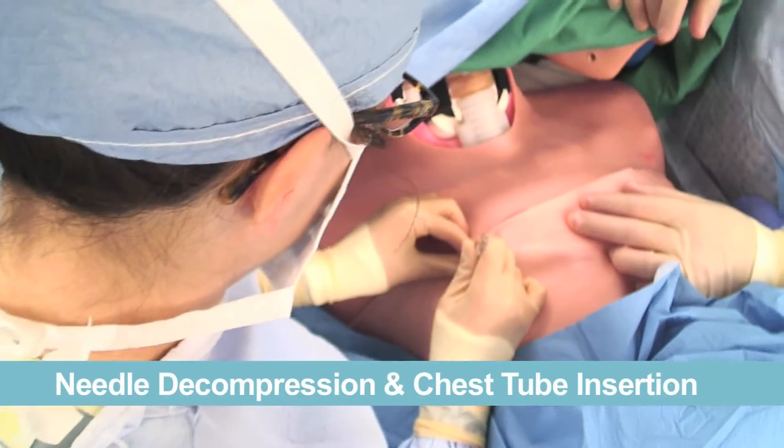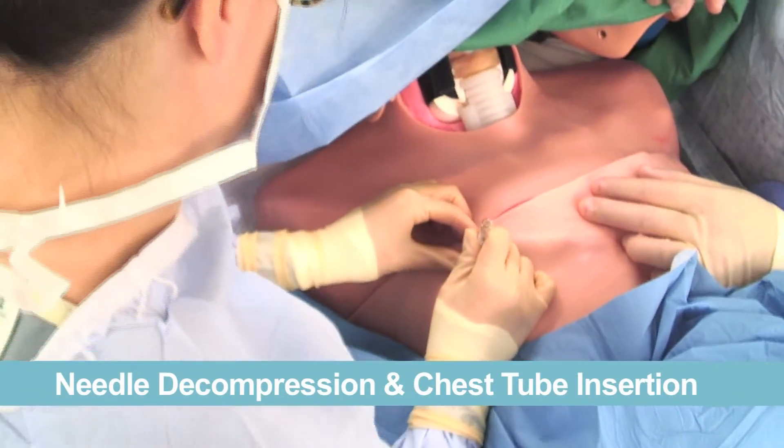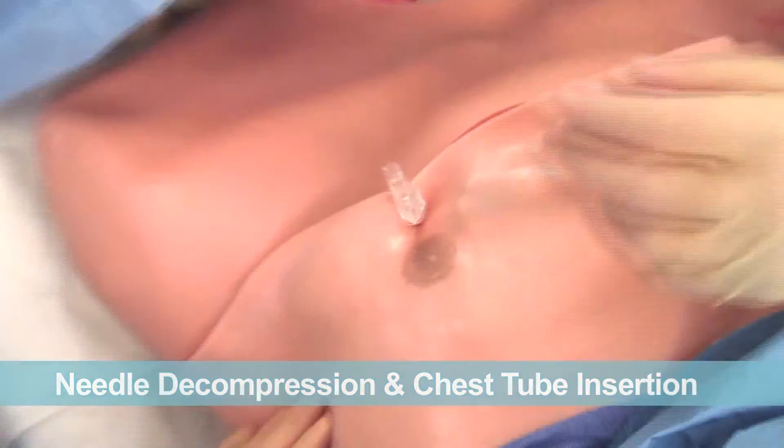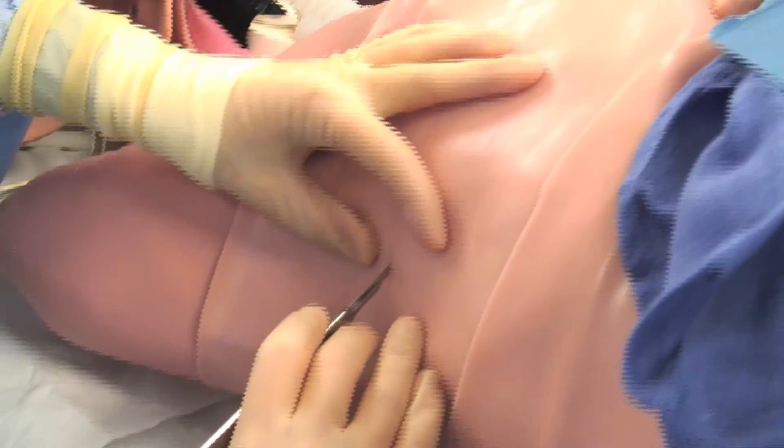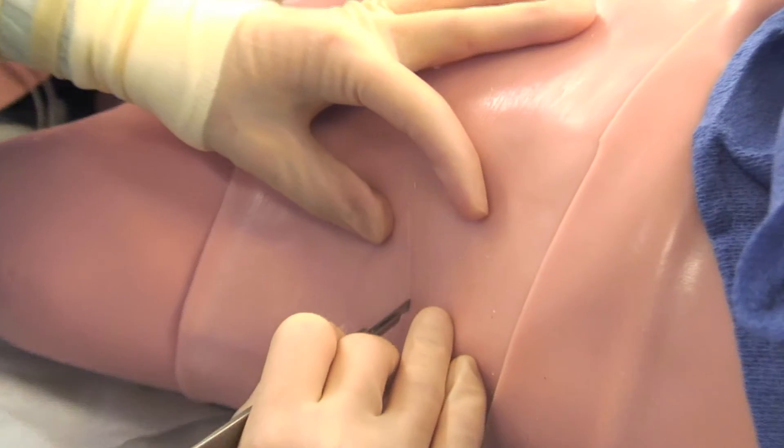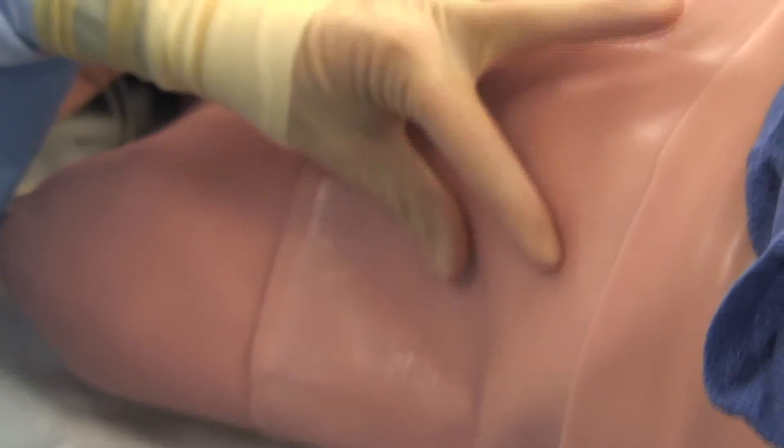Finally, here are some excerpts from our visit to LSU Hospital's Surgical OR In-Situ Simulation Team training event, which demonstrates the needle decompression and chest tube insertion.